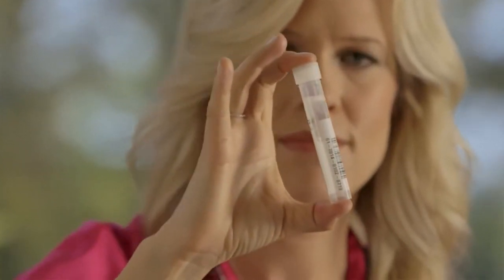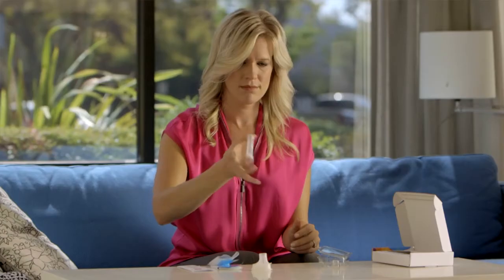Gently shake the tube to combine your saliva sample with the buffer. The buffer will preserve and stabilize your DNA for up to six months and at a wide range of temperatures. So if your sample travels through a heat wave or a polar vortex, it'll remain safe in the mail.